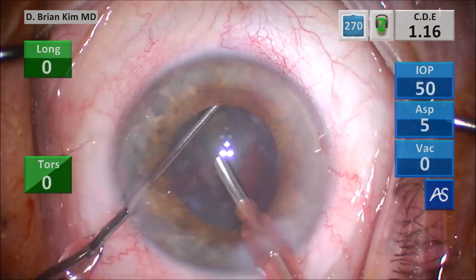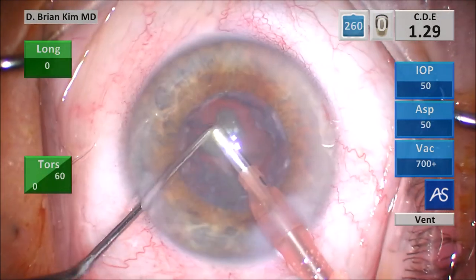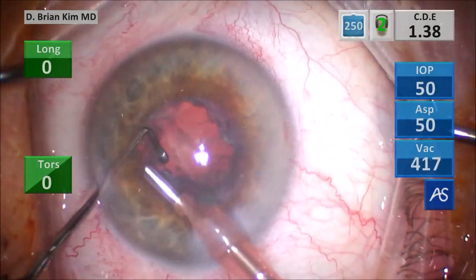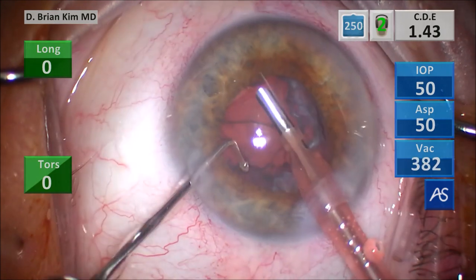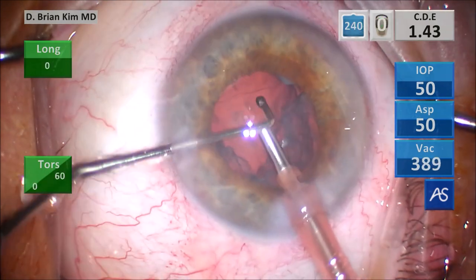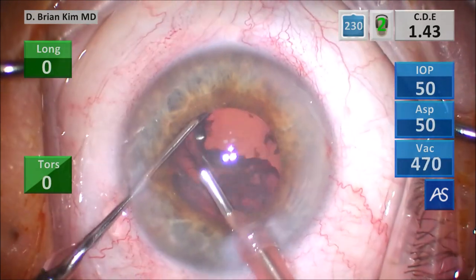Using some vacuum to pull that last fragment up, crushing the lens between the chopper and the phaco tip, and emulsifying the lens pieces. Once the endonucleus is removed, I'm going to start removing the epinucleus. But in this case, the epinucleus is very adherent to the capsular bag — this is a challenge. I'm trying to delicately grab the anterior edge of the epinucleus, but it wants to go right back. It's a thick and adherent epinucleus, so I'm going to try to get around it.